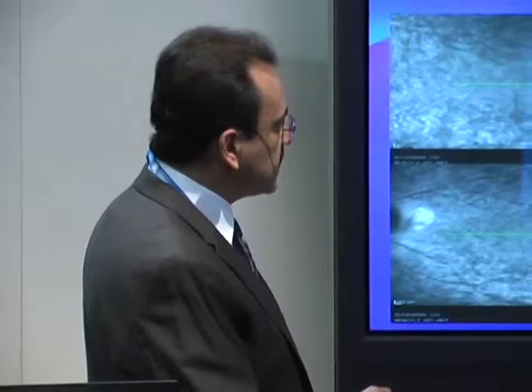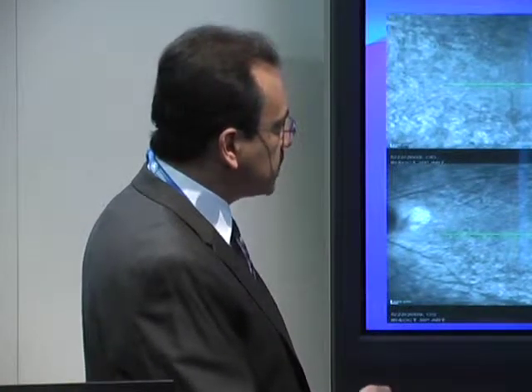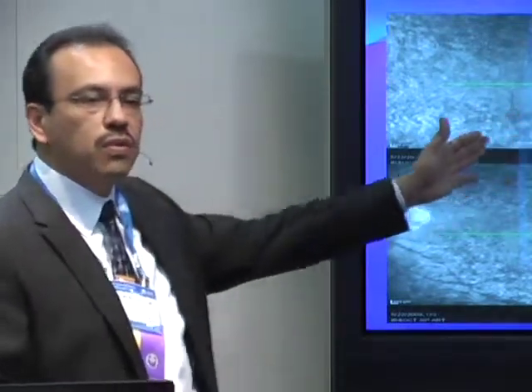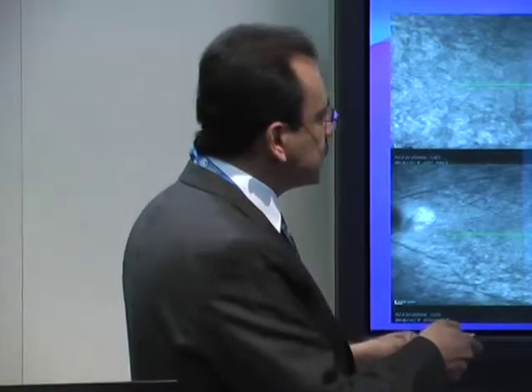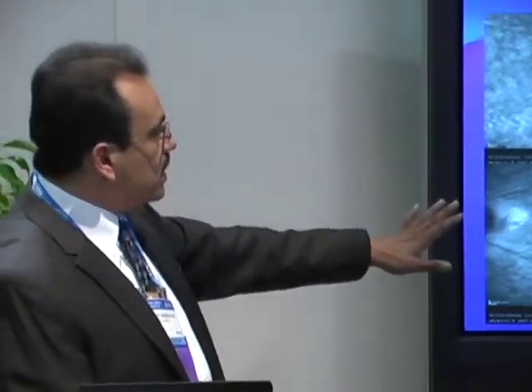Here again, the OCT shows us a very nice view of the photoreceptor layer that's still remaining in these eyes. It's wiped out here, which in a sense correlates nicely to the area. But again, you don't know what the functional status is of the tissue in the middle. Okay, and when you do the MP1, what you find is that they both have the ring, but now I'm more concerned because I'm starting to see some more central defects in this eye.